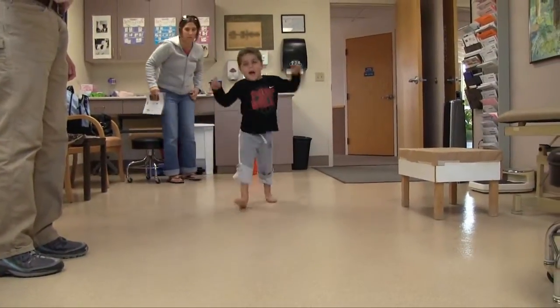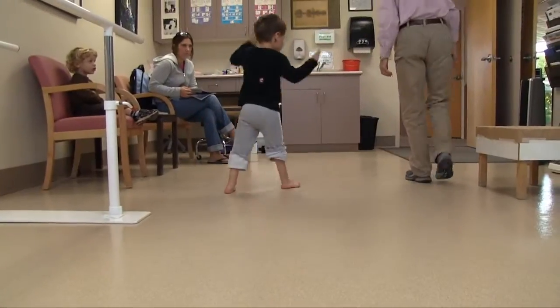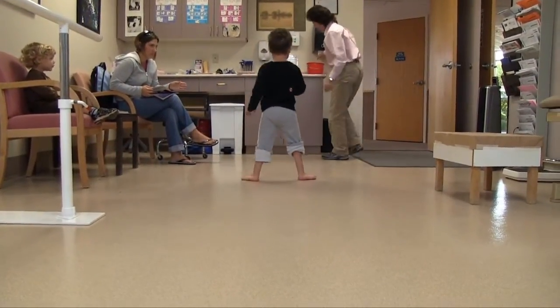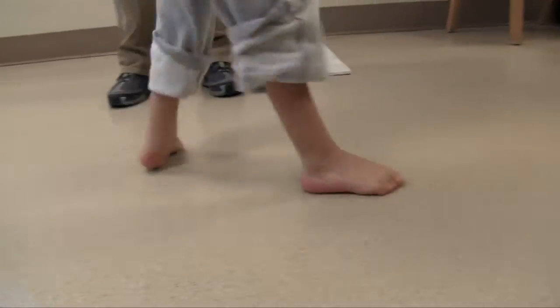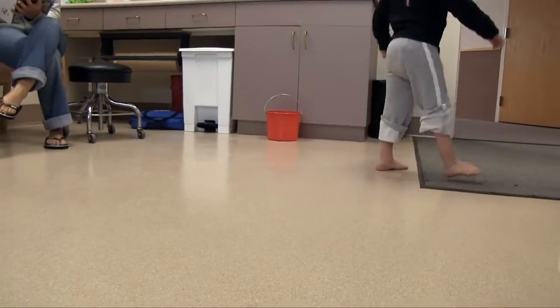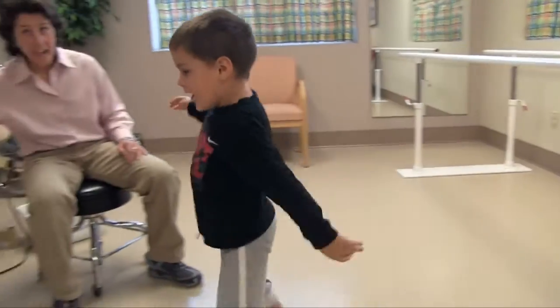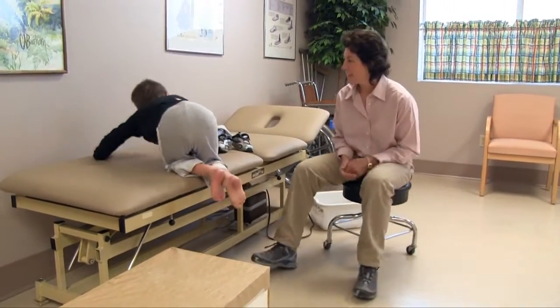Here he is walking without braces, and as you can see he pronates pretty excessively with a lot of external rotation. He has flaccid feet. He uses a lot of upper limb movement and trunk mobility to propel himself and also to maintain his balance.